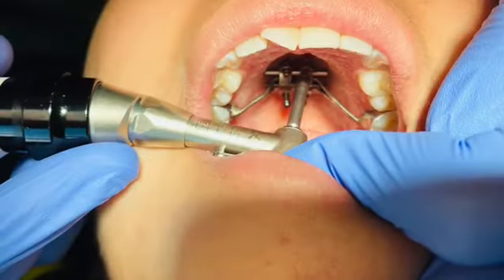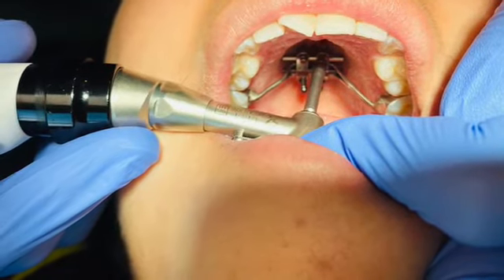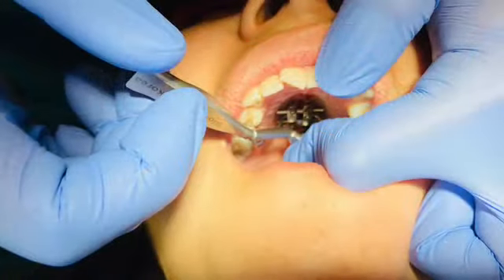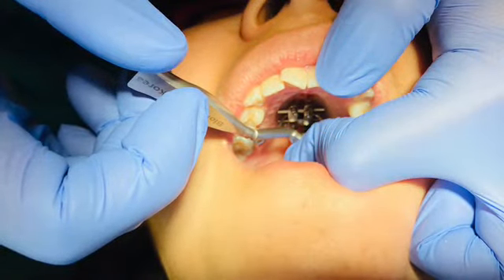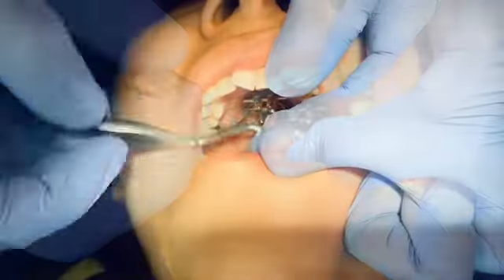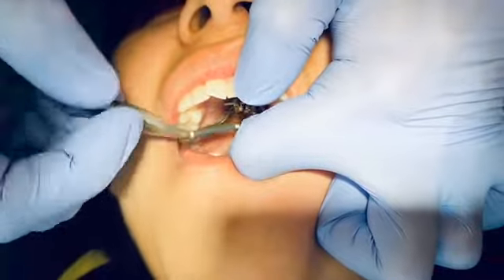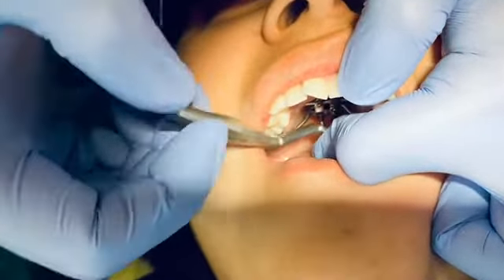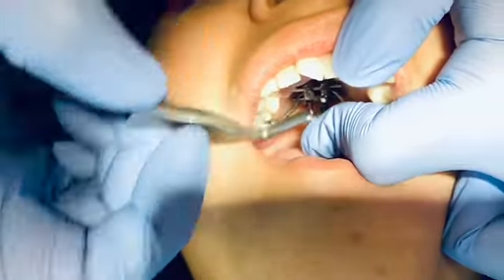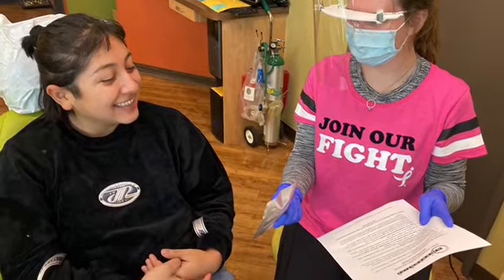During this process, patients have expressed molar pressure, a slight irritation of the sinus, and a desire to sneeze. And that's about it — then we just go over instructions with you on how to care for your expander and how to do your turns at home.